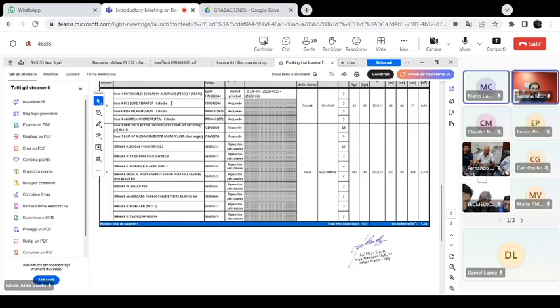Yes. So in this case, my suggestion is to share with us, with Romain or any contact you have, the serial number of the device that you intend to use for this demonstration to the committee in order to enable a specific license for this device.